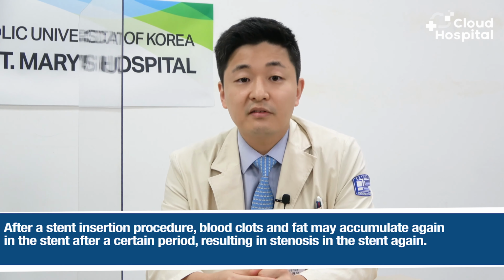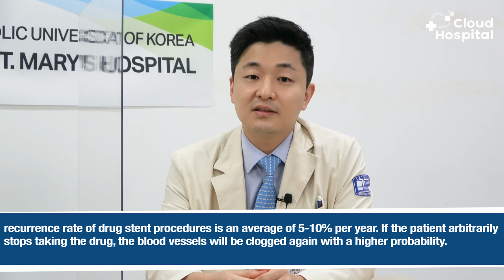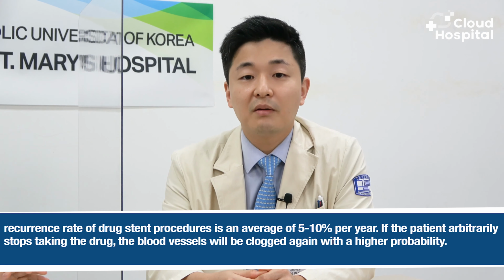How about the recurrence of arterial stenosis? After a stent insertion procedure, blood clots and fat may accumulate again in the stent after a certain period, resulting in stenosis in the stent again. There are differences in degree depending on the type or length of the stent, but the recurrence rate of drug stent procedures is an average of 5 to 10% per year.